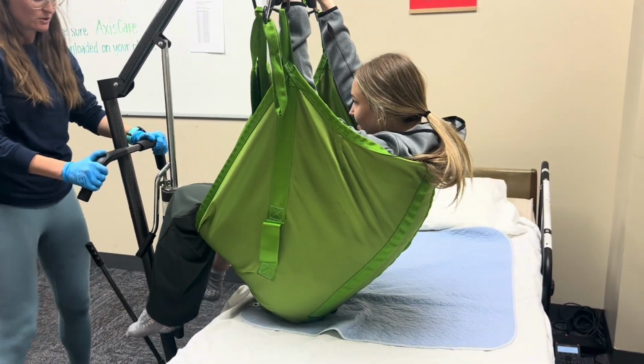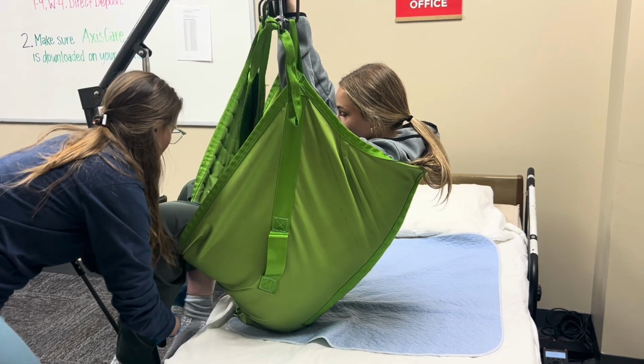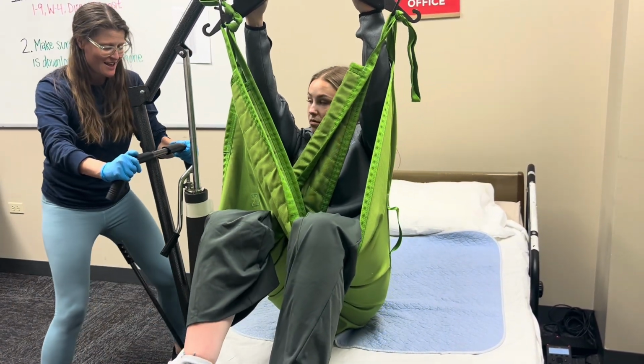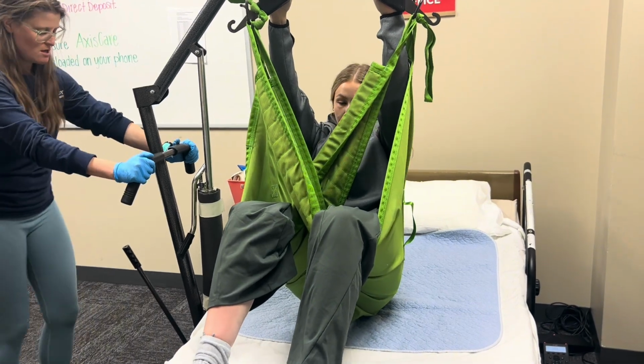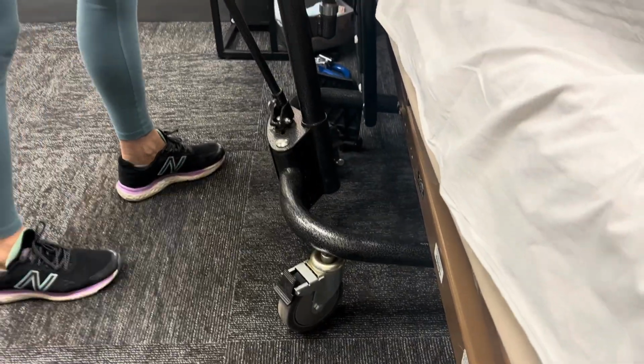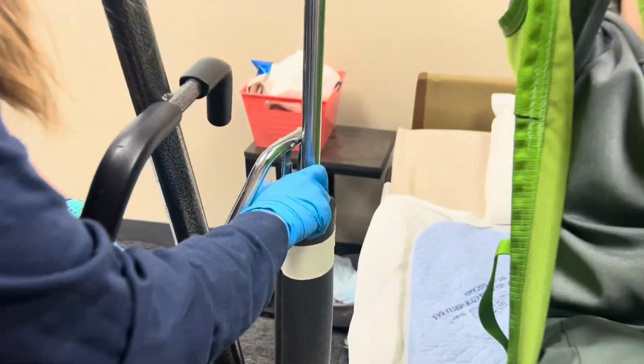Okay, so what I'm going to do before we get positioned, because I don't want her to lower in that chair form, I'm going to make sure that her legs, and we're also at a good spot towards the head of the bed. So, brakes are locked. Michaela, you ready to go down? Yes. Okay.